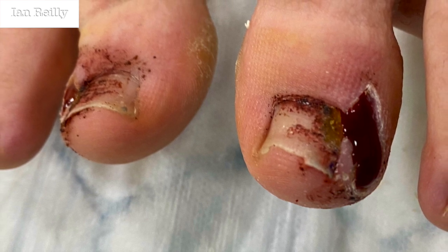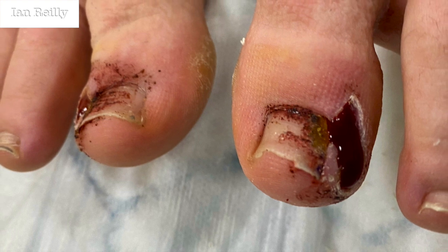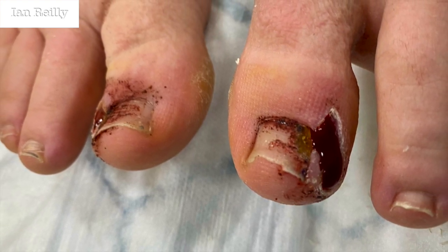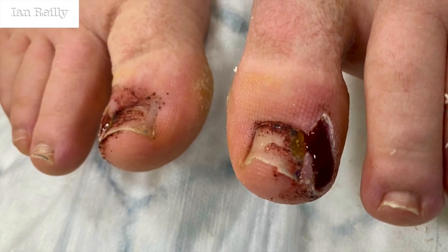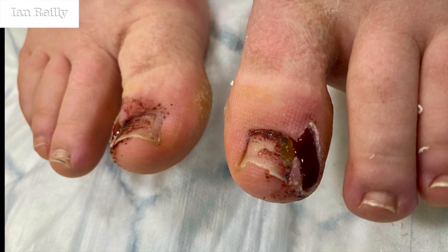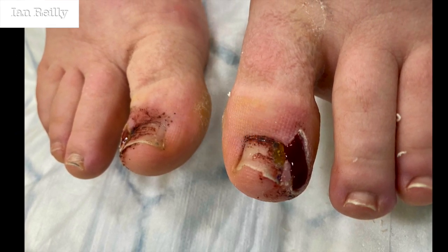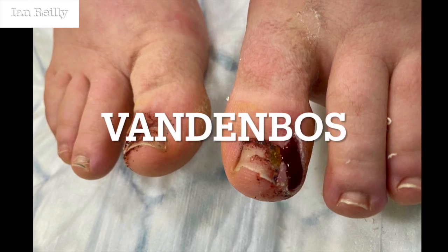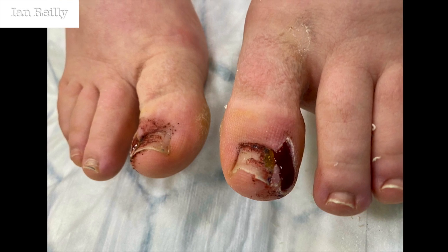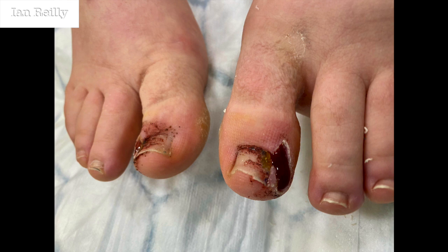And this is the following week. This is following taking down of the dressing, the non-adherent dressing. You can actually see I'd done both toes. It's just the left foot I'd done for the video, but I'd actually done the other foot directly afterwards, on what I would call a Bose procedure, Bose 1971. There's somewhat of a fine line between a Bose and the true Vandenbos. The true Vandenbos and Bowers 1958 is more aggressive, but it's really from the thick to the thin end of the same wedge.